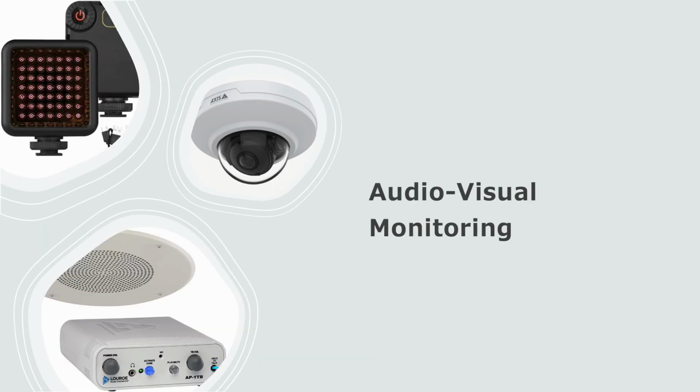For the patient's recording room camera, it could either be controlled by a computer if it is an IP camera, or it can be controlled by a control box. Every device that connects to the internet, be it your cell phone, your computer, your smart TV, has something called an IP address, which is the way the internet organizes who is online. IP stands for Internet Protocol. An IP camera is a camera that can be controlled over Ethernet and has an IP address. Phone, voice over IP, or VoIP, is another internet phone service. Some head boxes have IP addresses, and some CPAP equipment also has IP addresses.